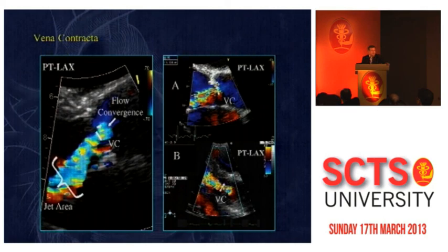So this is the acceleration zone. Before the orifice, the flow will progressively accelerate towards the orifice. And it will do that in an isovelocity manner. So several shells, like an onion, with different velocities, increasing velocities as you approach the orifice. And of course, at one point in time, the velocity will be exactly the one at which you have this color coding change imposed by the machine. And so you can beautifully see the boundary between the blue and the red.